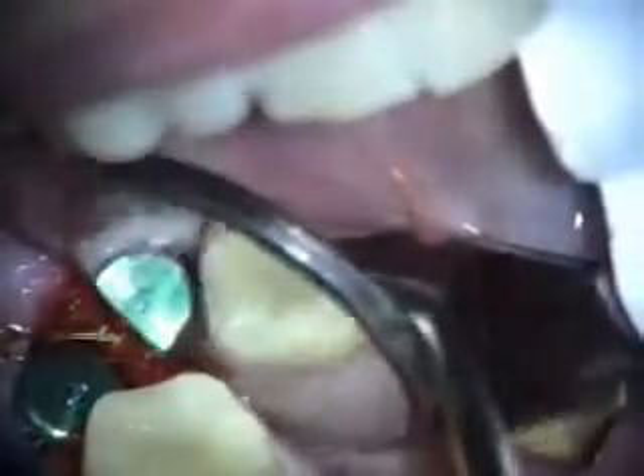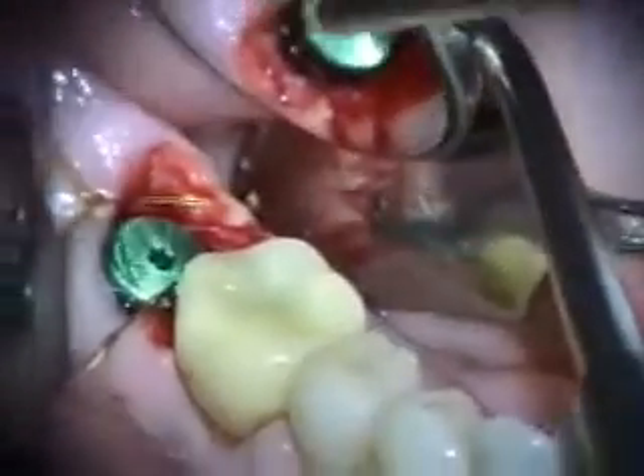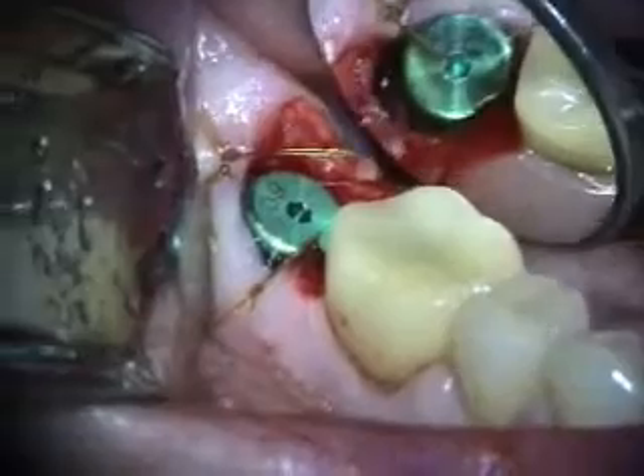You can see I trimmed a little bit of the lingual tissue. The lingual tissue is kind of thick, so I trimmed that a little bit. We'll take a look at this in a couple of weeks.